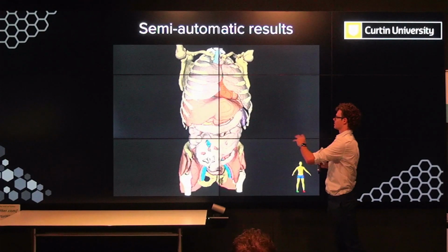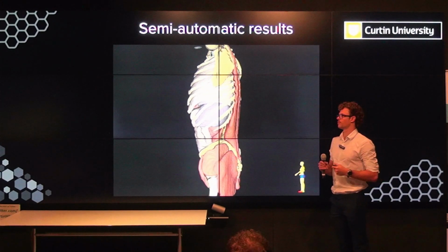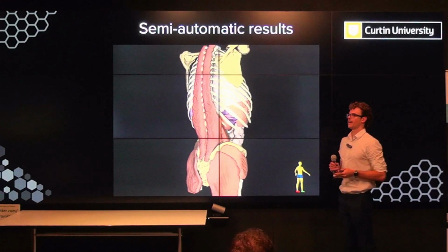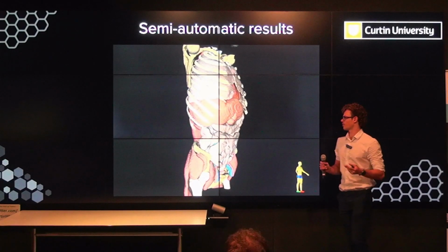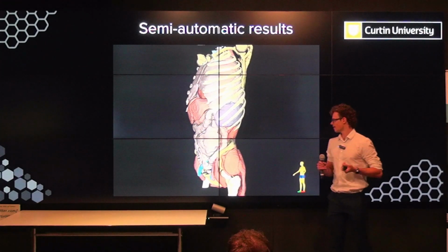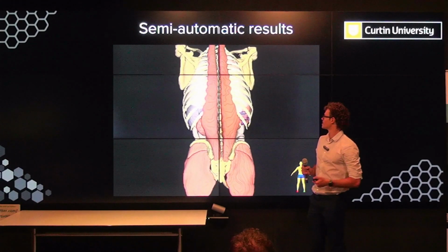This in total depends on your computer specifications, up to 5 minutes. This one was 5 minutes by hand, which I had to also do the renal arteries because that wasn't done automatically. And the branch vessels, like the superior mesenteric, celiac trunk, hepatic, splenic, left gastric, they also weren't done, so they had to be done by hand as well. I think it's really interesting to note how I got the musculature on really well. The pelvic musculature right over my head in anatomy class. So it's really cool to see it on here, and especially the spinal musculature too.